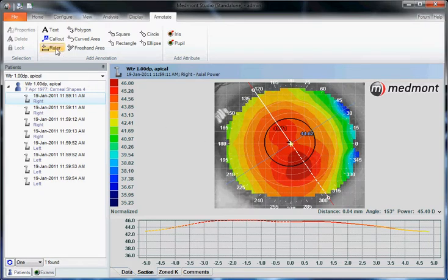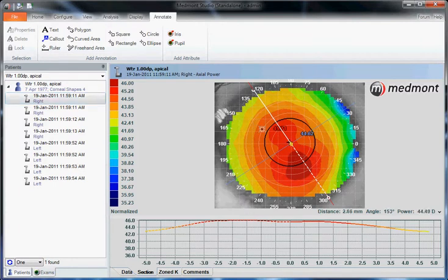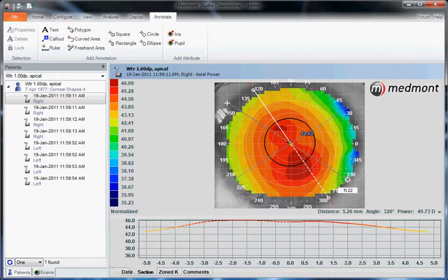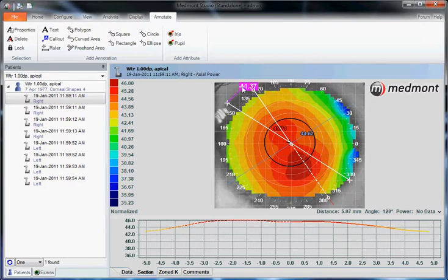For instance, if we wanted to measure the visible iris diameter, we could click on ruler. Find the white of the eye and its border with the visible iris. Run our ruler across the center of the grid, the center of the topography. Find white on the opposite side, click our cursor again, and that gives us the measurement of this particular ruler running white to white.